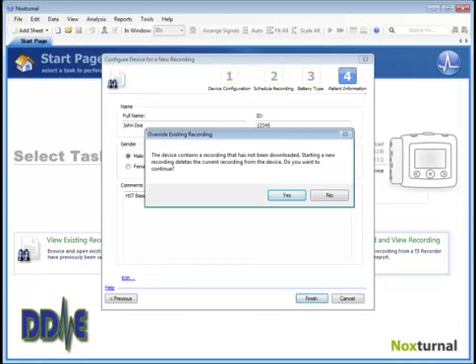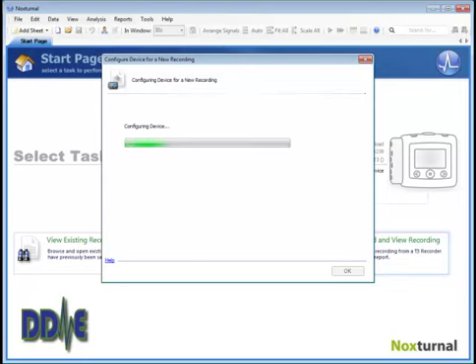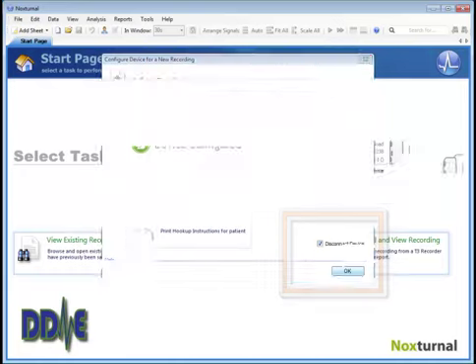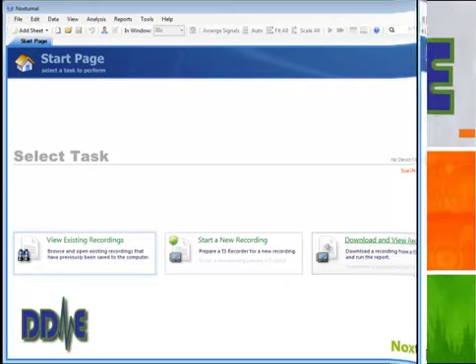Click Finish, and when you do that, a file will be sent to the T3. When that file is successfully sent, you'll get a message — click OK. Then disconnect the USB cable, insert the battery, and you're ready to give the T3 to your patient.